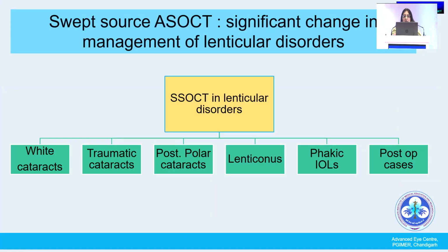Now, there are multiple purposes for which the swept source OCT can be used. In fact, even in our department, beyond the cornea surgeons, it is the glaucoma surgeons as well as the strabismus surgeons who are using the OCT as much as we are. But I limit myself to the corneal and lenticular applications. The swept source OCT has brought about a significant change in the management of lenticular disorders because of our ability to see the lens.